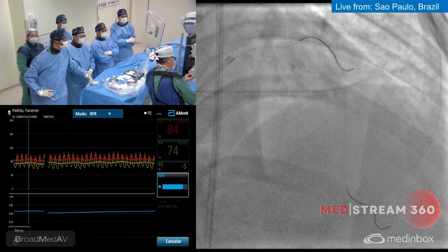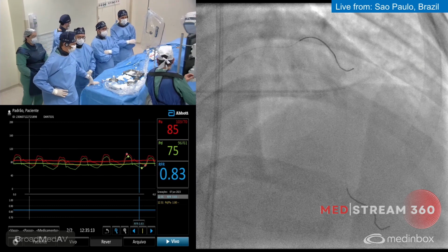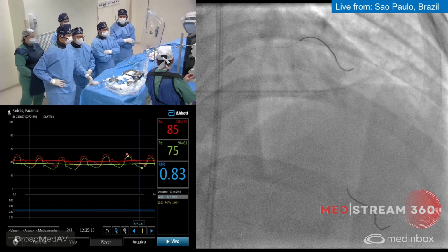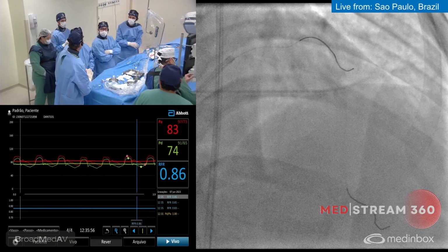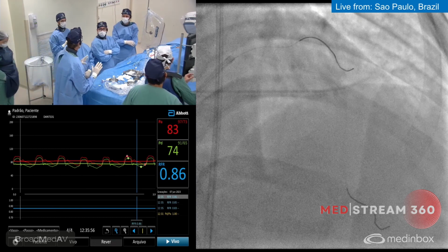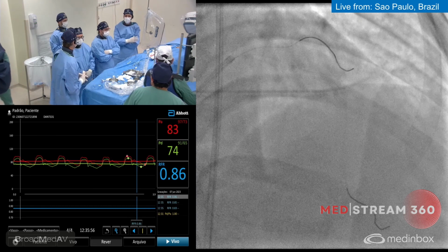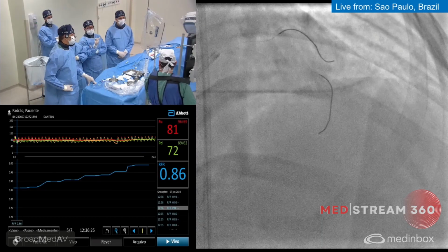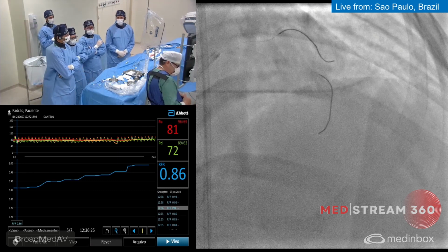So we do the non-hyperemic RFR from St. Jude. So it's 0.83. This is quite below the cutoff, which is about 0.89 and below. It's always good to repeat this measure. Okay, 0.86. So you have three measures, 0.83, 0.85, 0.86. Do you think it's easily positive? I think it's quite positive. Positive. But we can do the pullback as well. 0.93 in the mid portion, and you have 0.86, so we will gain like 0.07.